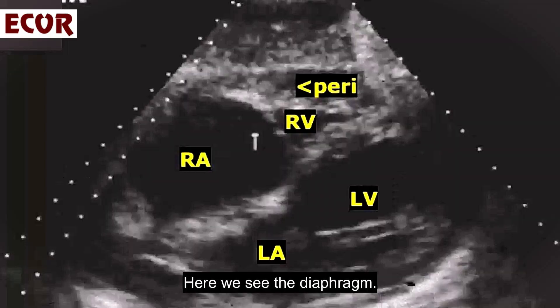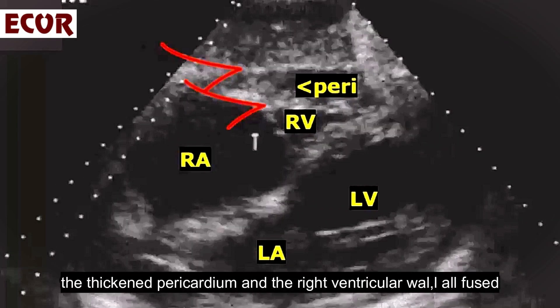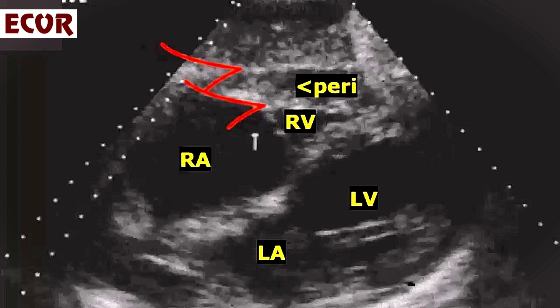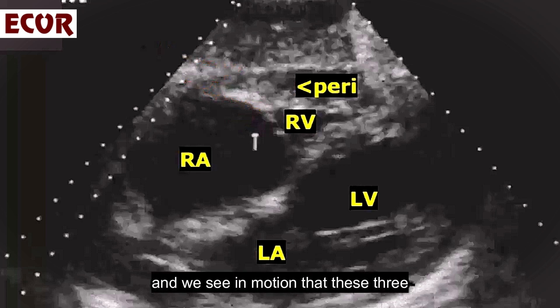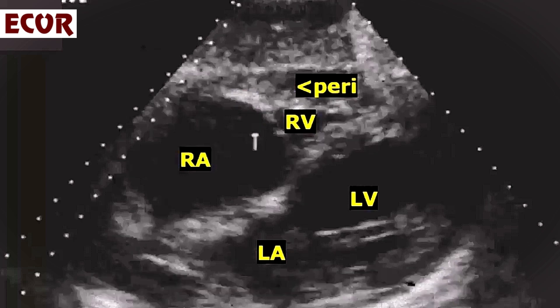Here we see the diaphragm, the thickened pericardium, and the right ventricular wall, all fused. We see in motion that these three structures will be moving as one, pulling the diaphragm.